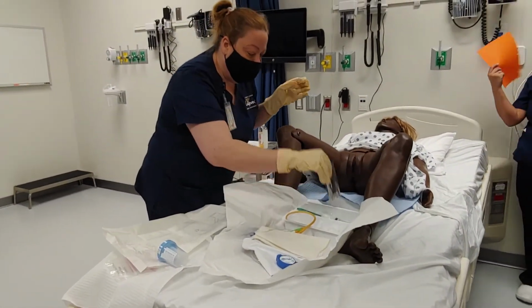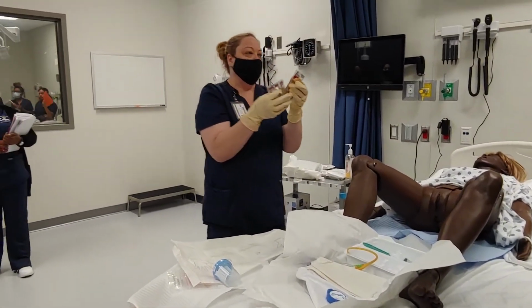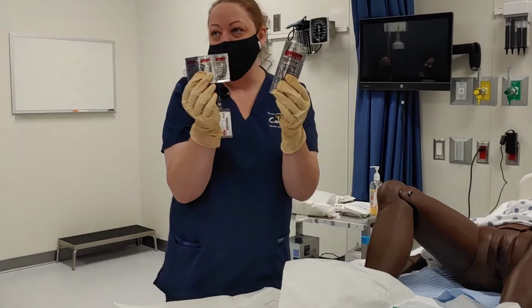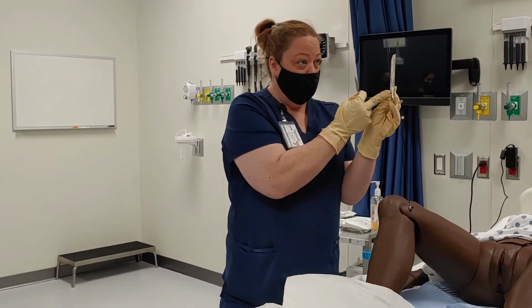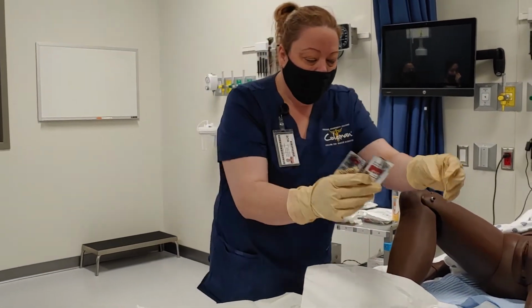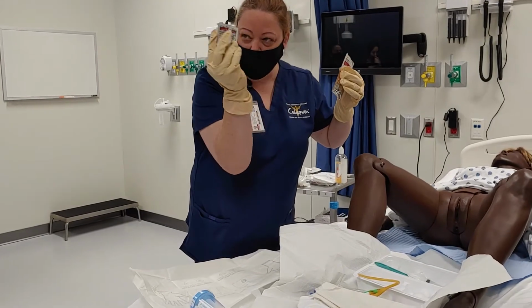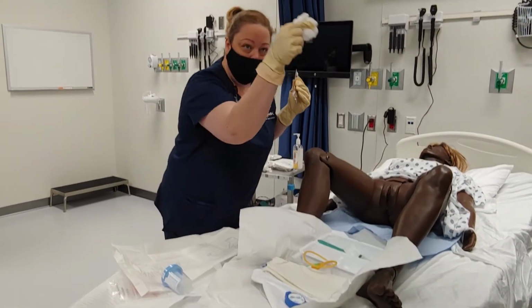The next thing I'm going to do, you have two different options here. This is povidone iodine. You have ones that are on like a large cotton swab, and then you have some that's just the liquid that's contained in it. I'm going to pour this out. If it's just these, I'm going to pour it out onto the top of these cotton balls, okay?